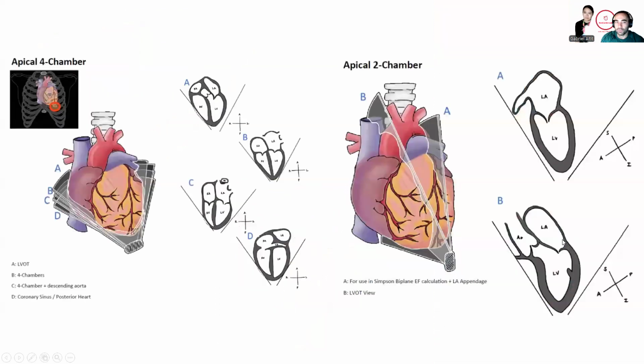to get a nice apical view. And so in the apical view, we can do a sweep from anterior to posterior. And so from anterior to posterior, we would see initially in the mid zone that typical four-chamber view with the pulmonary veins. As you go more posteriorly, you can see the RV, the LV, and the RA, but you actually see the coronary sinus draining the coronary system into the right atrium. And as you're getting more anteriorly, you can actually see more of the LV outflow tract. And eventually, if you go even anterior, in some patients, you can appreciate a bit of the RV outflow tract.